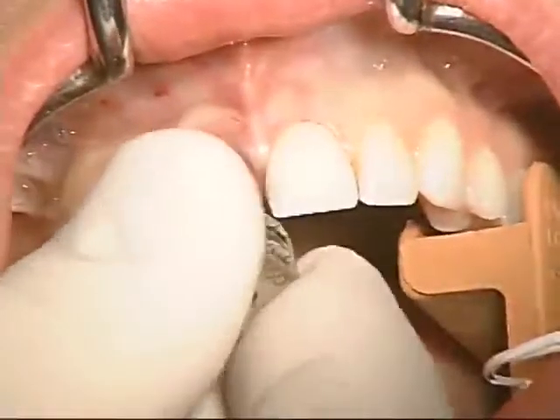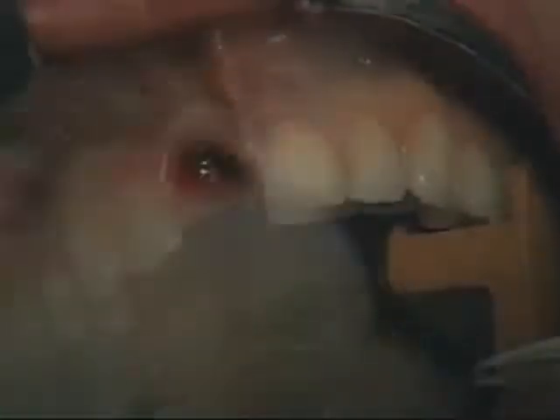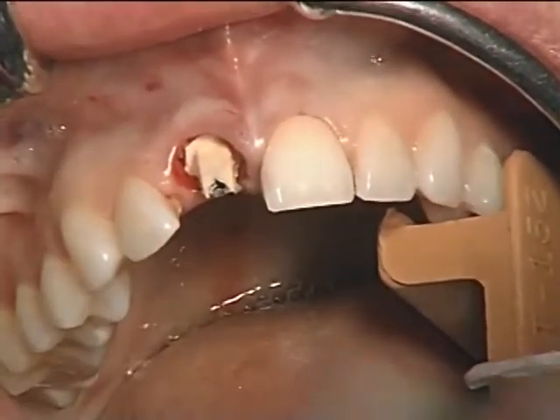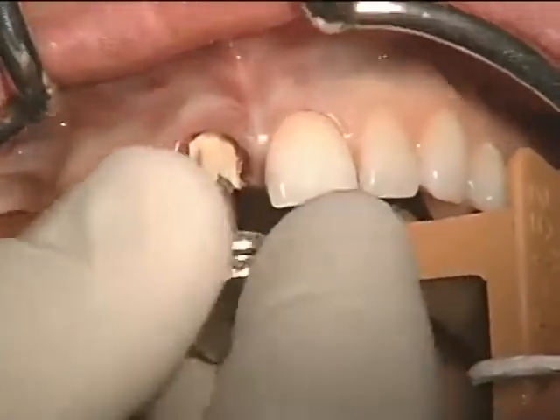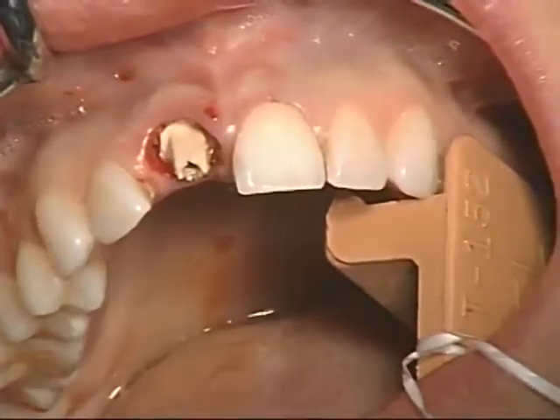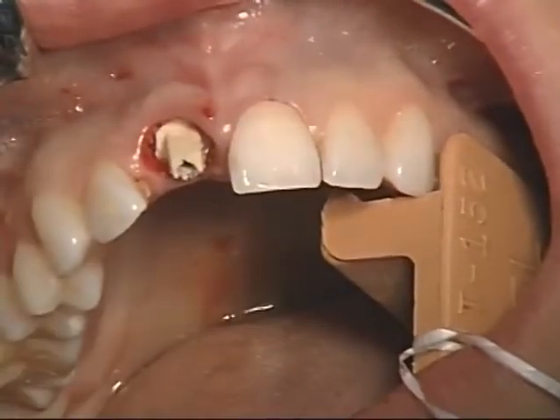Screw proceeds. Placement of the prepared provisional abutment. This abutment was prepared chair side to appropriate dimensions. The abutment is then secured back over the implant surface itself, and the cover screw is hand tightened. After removal of the wings of the temp stent and the placement of some bonding agent in the provisional itself, we will try the temp stent on and off the provisional abutment to confirm our preparation.